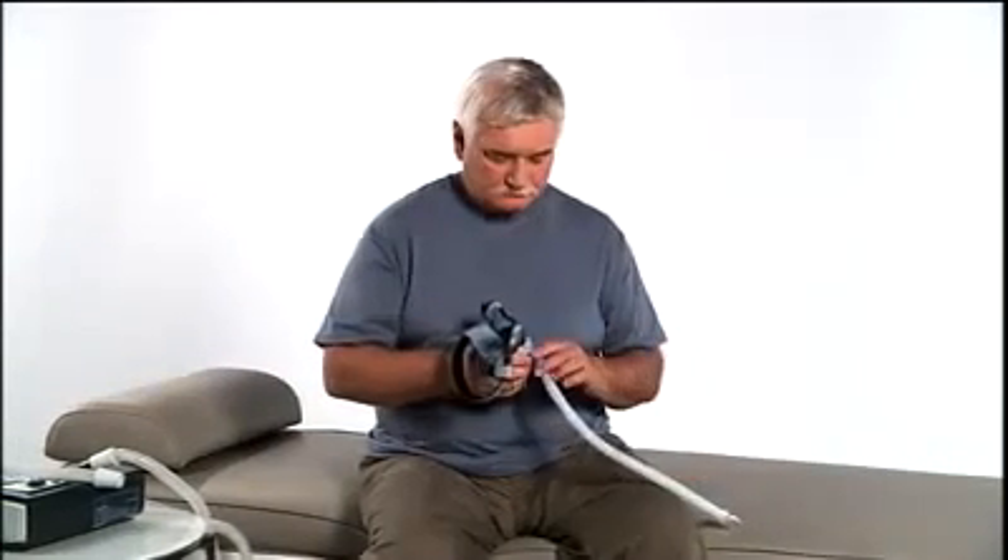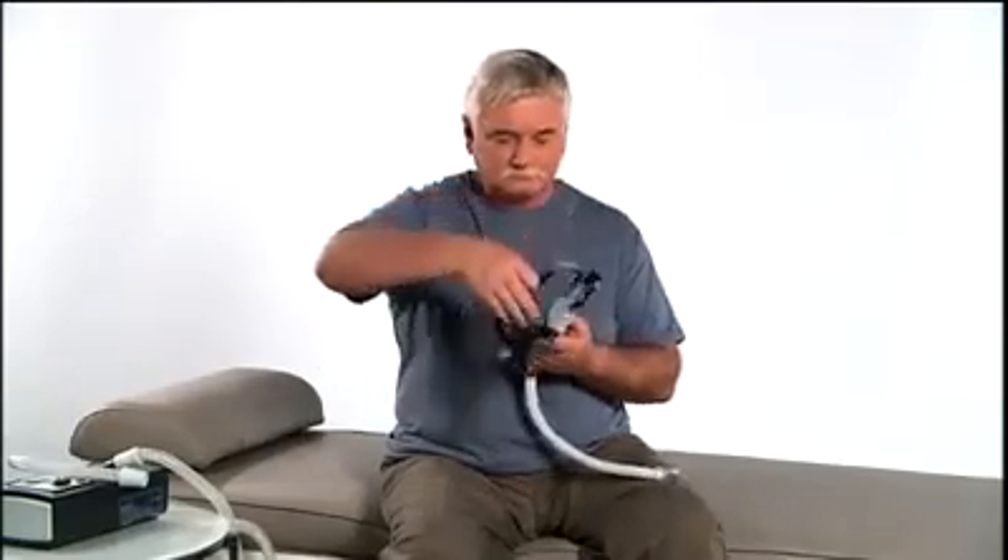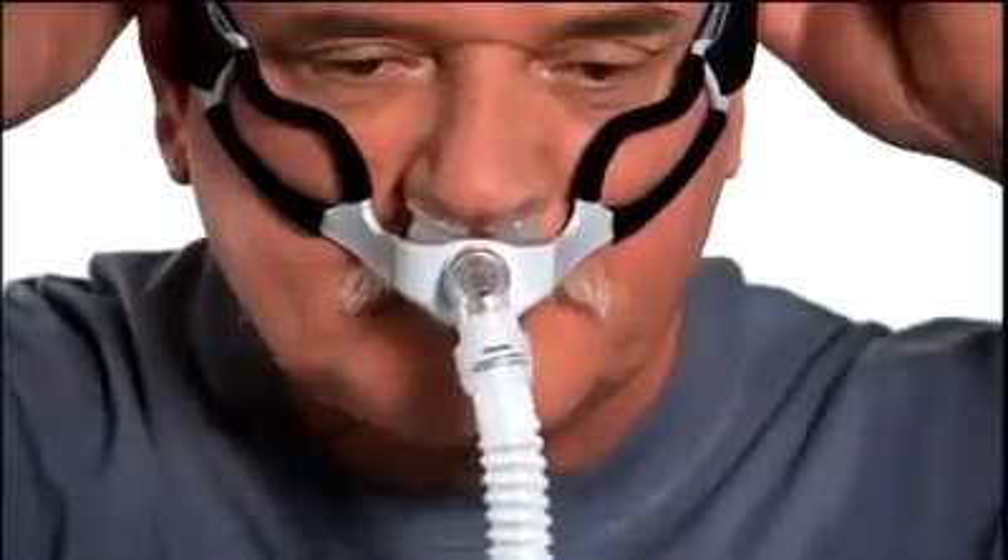Go-Life is designed to go on quickly. To put the mask on for the first time, pull the headgear over your head. Place the cushion into your nostrils.